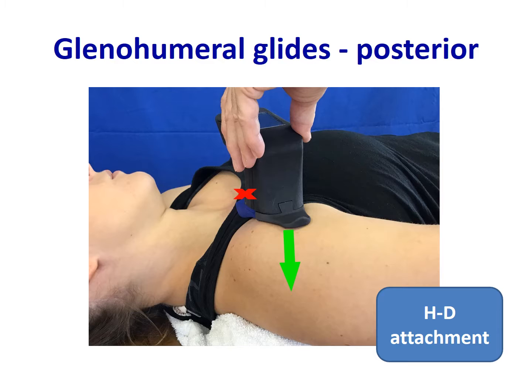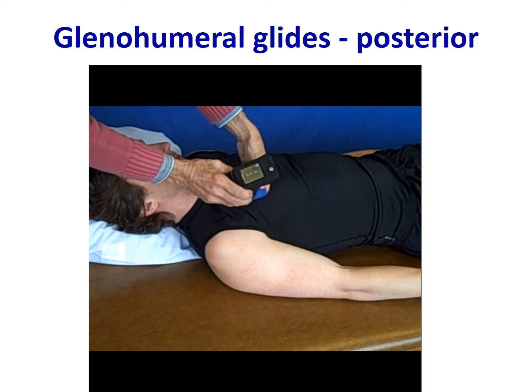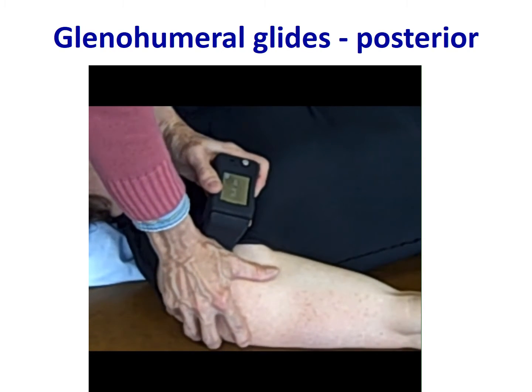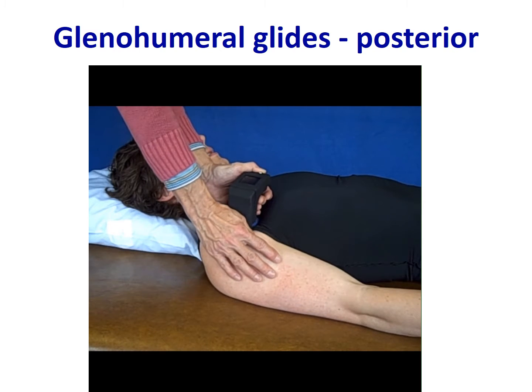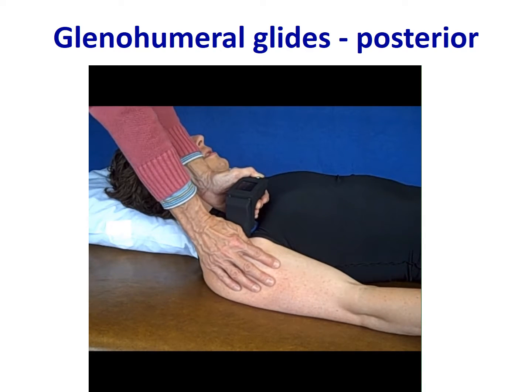Here you see that same positioning being used with the Mobilator device. The blue HD attachment is used to quantify posterior glides. The blue attachment slides into the dovetail and locks into place. The joint line is identified, the device is aligned with the joint line, and a posterior glide of the humerus on the glenoid is performed. You can see the quantification of that technique and the oscillations within a particular range of joint motion.